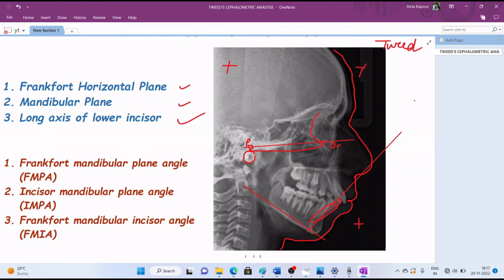On joining these lines and extending these planes backwards, what you will get are three angles. This is the FMPA, the Frankfurt mandibular plane angle, which is formed by the intersection of FH line and the mandibular plane.